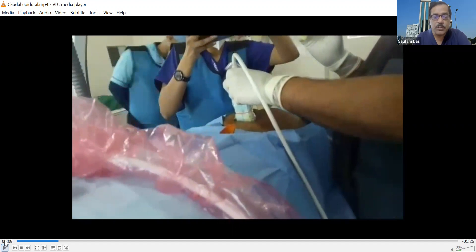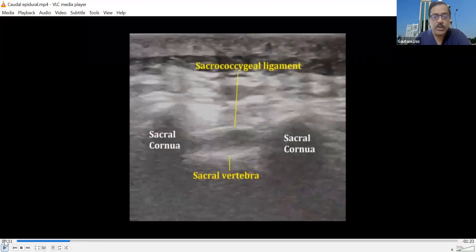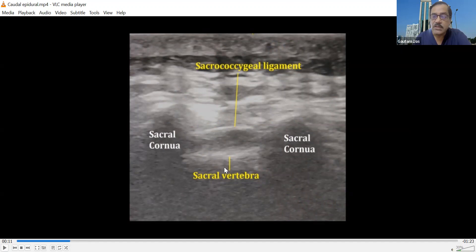We are now holding the probe in short axis and we get this picture. Here are the two sacral cornua, and in between, the upper white hyperechoic line is the sacrococcygeal ligament, and the lower white line is the sacral vertebral body. You can see that the ultrasound beam cannot pass through it — this is the sacral hiatus, and we have to put the needle here.